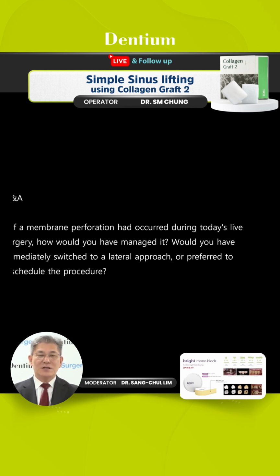When you perform sinus elevation with a crestal approach, sometimes a small perforation will happen.